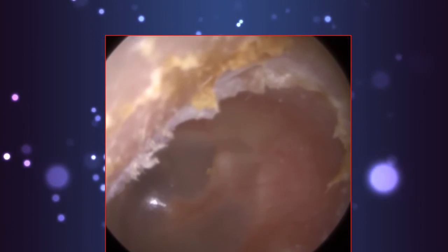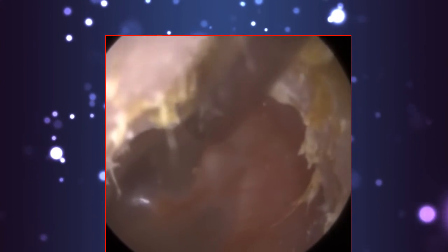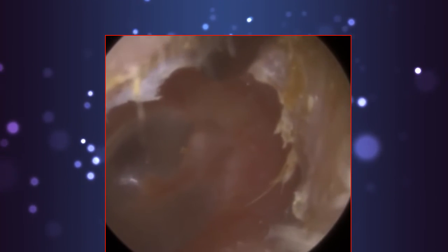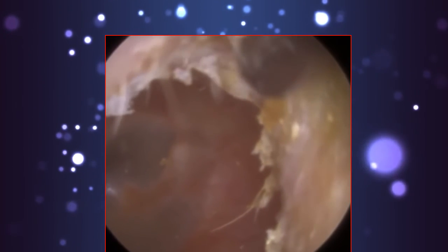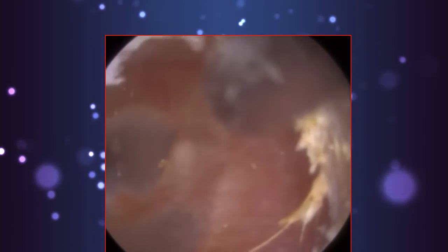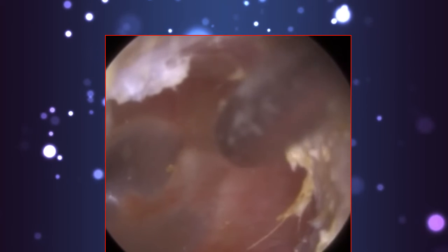When you've got a patient with a very narrow, twisty ear like this, we just have to really stretch the ear open. If we can straighten that first bend to make it in line with the second bend, it turns the ear canal into a straight cylindrical tube. Otherwise, the ear canal is like an S bend. And with two instruments in the ear, or even one instrument, if you've got the sucker, that's a straight instrument. It can make it difficult to navigate the bends of the ear. So by straightening the ear, you can use straight instruments. You can make the procedure much easier, basically, for yourself. So we're having to do that with this patient on both sides. The ear canal is very narrow, very bendy as well.